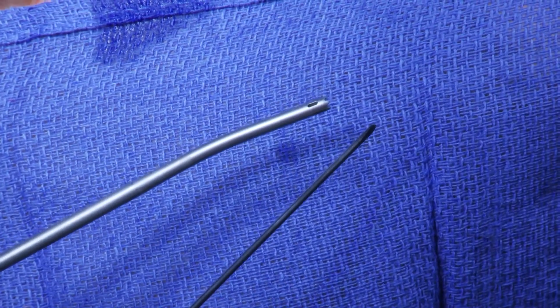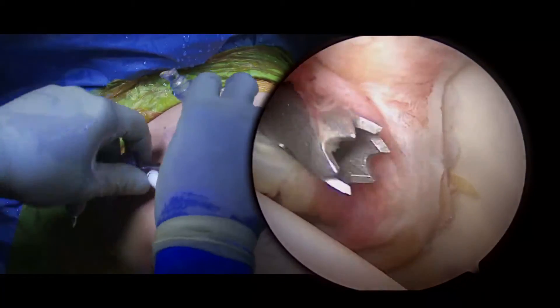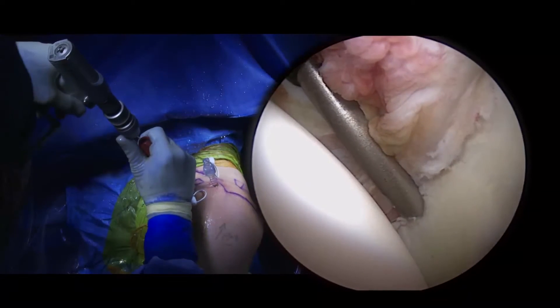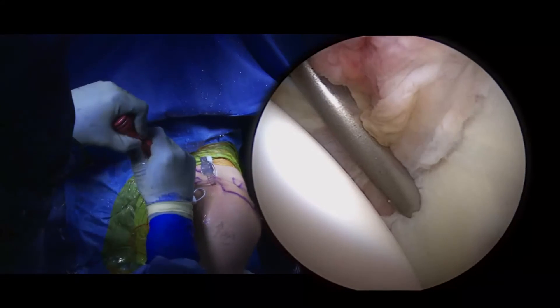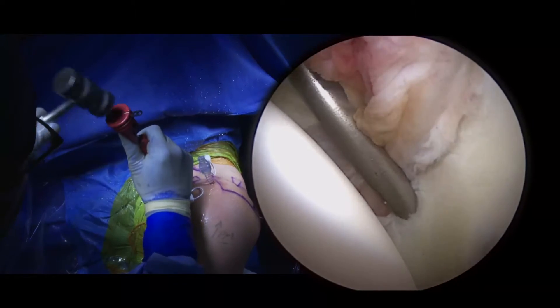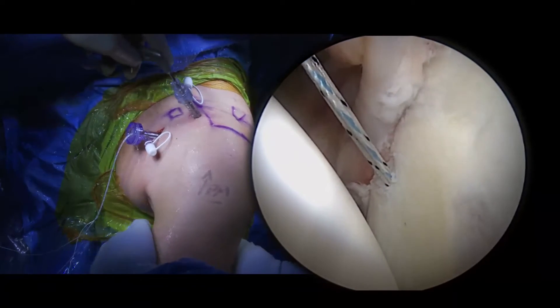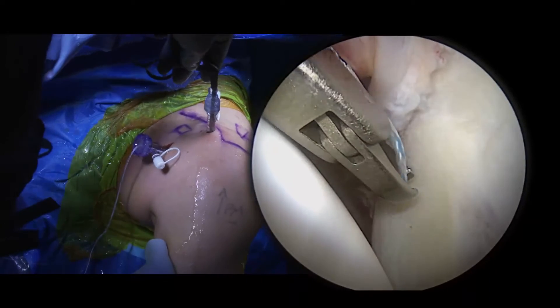A curved drill guide with a flexible drilling pin is used to place an all-suture soft anchor. The cannulated drill guide is placed through the anterior inferior portal at the 5:30 position, 1-2 millimeters medial to the glenoid rim. The all-suture anchor is placed through the cannula into the bone tunnel initially by hand and then fully seated with a mallet. The working repair suture is then shuttled out of the anterior superior portal.